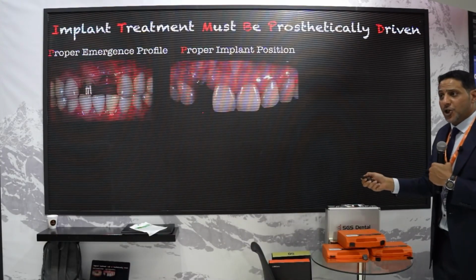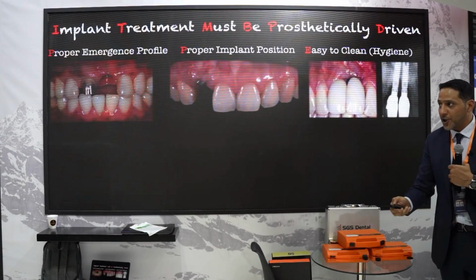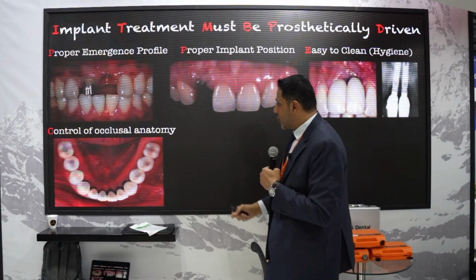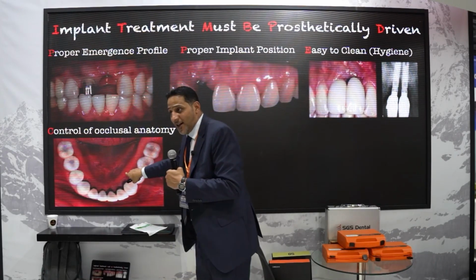Proper implant position. Easy to clean for the hygiene of the patient. Control of the occlusal anatomy. So if you have the implant in the middle here, the occlusal anatomy will be fine. Not in the ridge, not in the cusp. Okay?